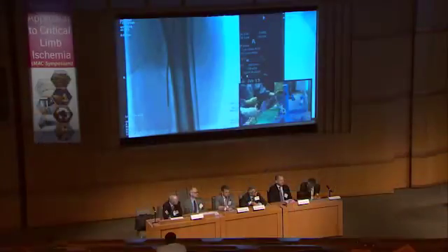Yeah, I think Dr. Soga's presentation was very elegant in that regard. I think the more you open, the better in terms of achieving wound healing. These are likely to restenose, so if you start out with 3 vessels open rather than just one, even though it's the angiosome-related artery, you have a better chance of success. So I'm going to quote you, gentlemen, in my debate at SCI.